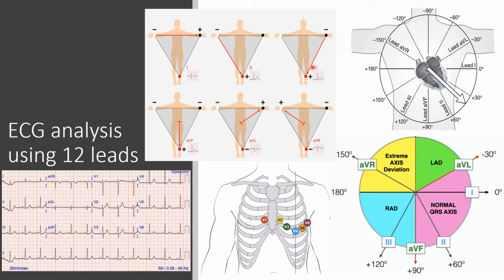That was the guy who actually came up with this, and he discovered it, so we call it Einthoven's triangle. And again, this Einthoven triangle is giving you a view of your heart from different angles. Lead 1 right here, this angle, lead number 2 showing you from this angle, and lead number 3 is showing you the heart from this angle right here.